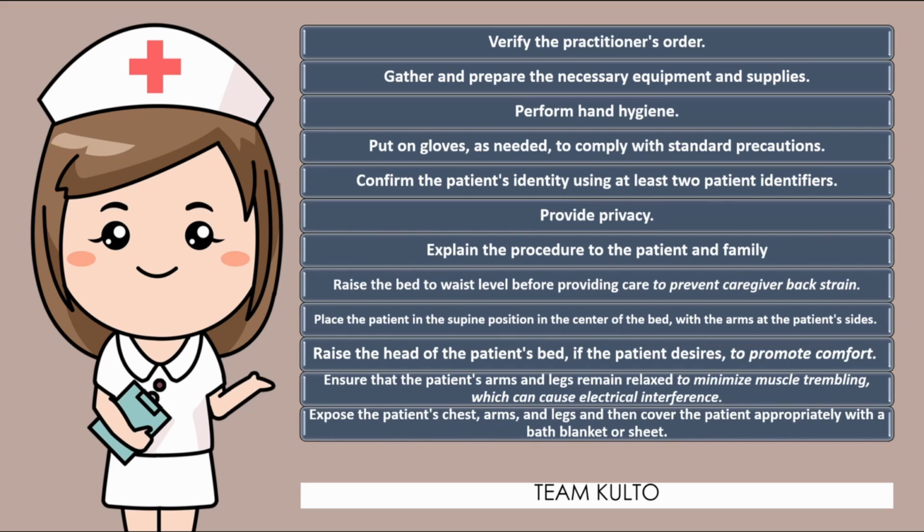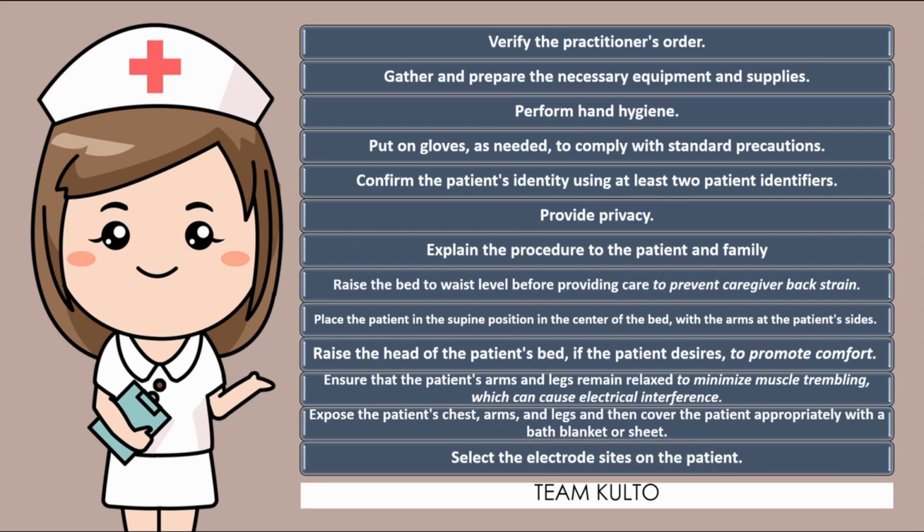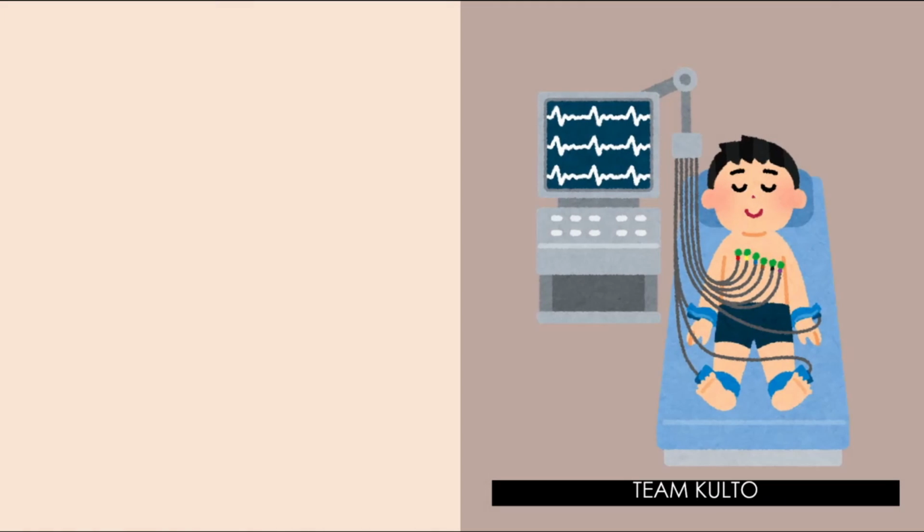This is one way for you to prevent exposure of areas of the body of the patient that is not really needed. Next, select the electrode sites on the patient. Saan mo ba ilalagay? Mamaya malalaman mo. Proceed na tayo. Continuation na ito ha.